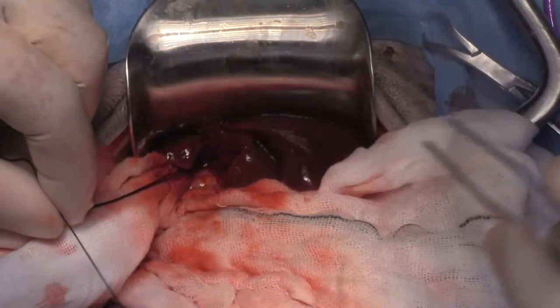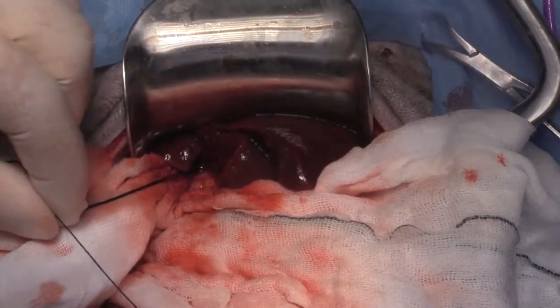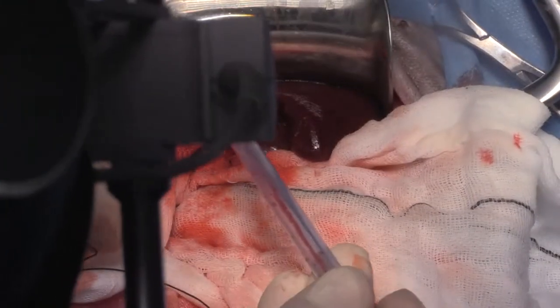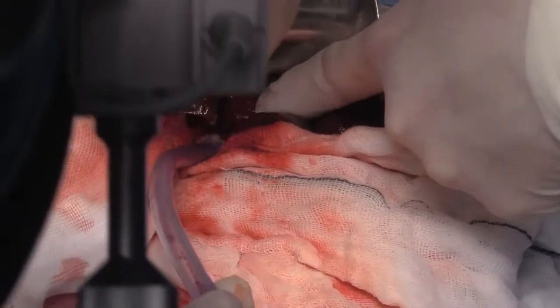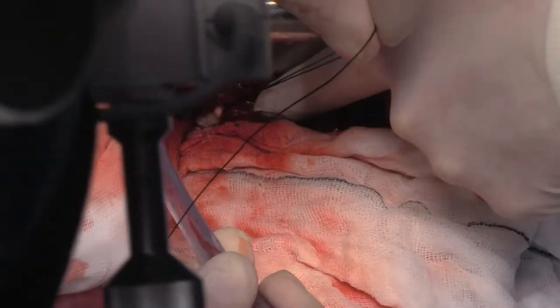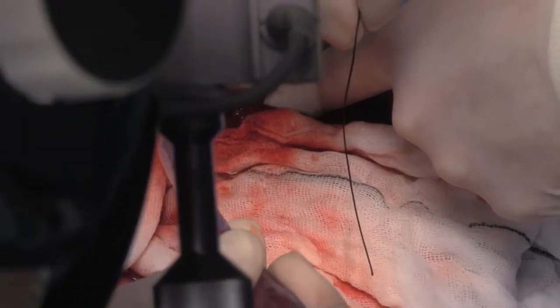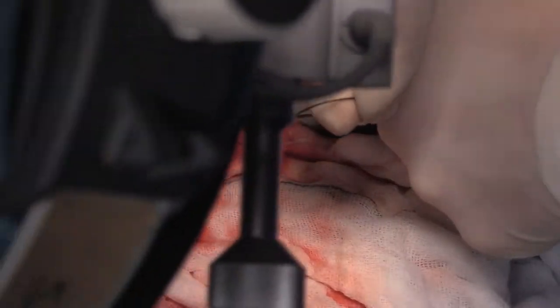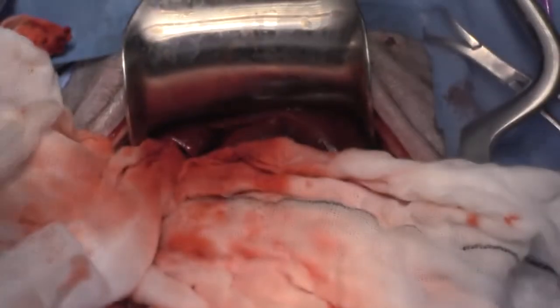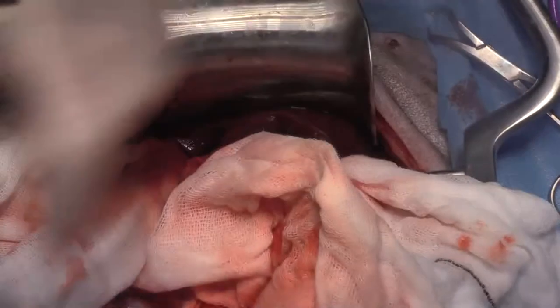Okay, so just get a bit of suction down there and check what that looks like, see if we can get you guys a bit of eyeball on that. So Jeff, can you try and pull some of that liver up? Just there. So I'm not sure if you can see that or not. We've just got our suture around the cystic duct that we've just isolated, then ligated and divided. I'm just going to cut these sutures. And that is the cholecystectomy.